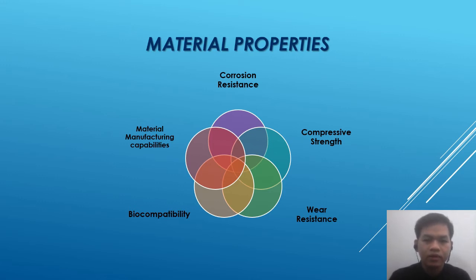Next is biocompatibility. Biocompatibility is another vital factor for selecting the material for the surgical implant. This is because without the biocompatibility, the material might be toxic, brittle that may cause injury to the user. Lastly is material manufacturing capabilities.